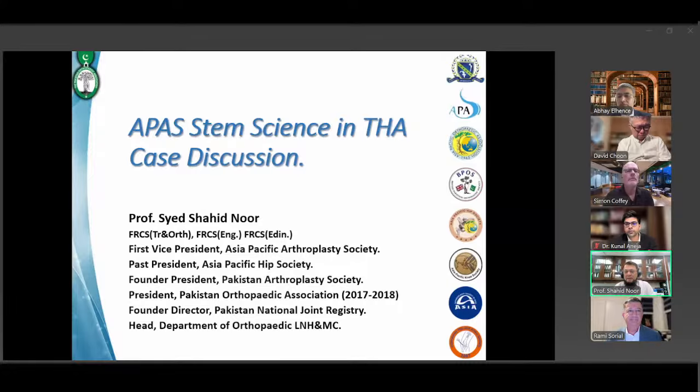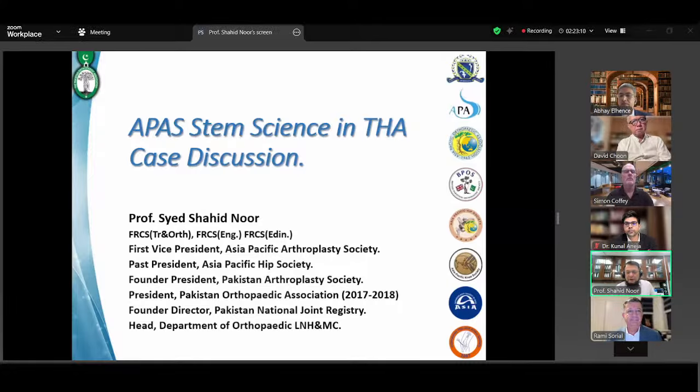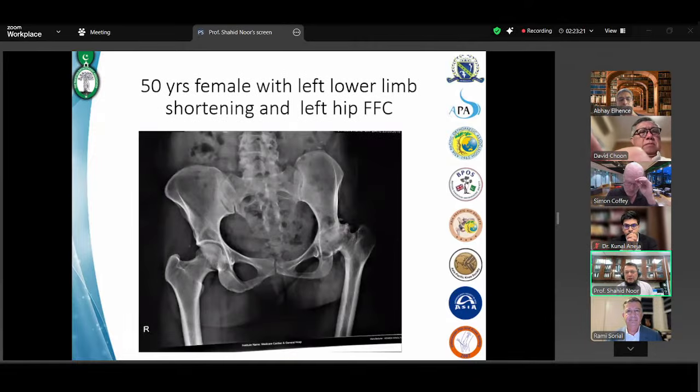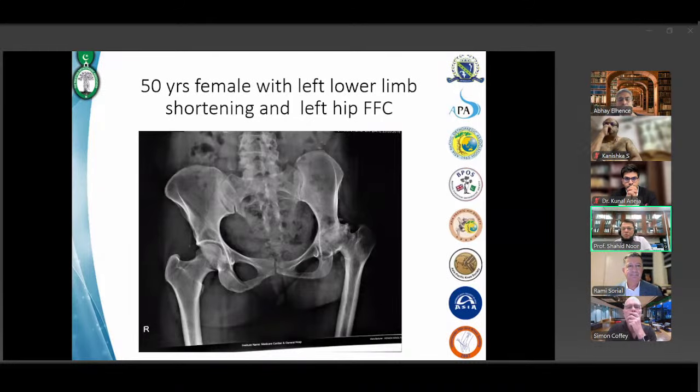Yes, thank you very much, Abhay and Rami, for excellent presentation on different aspects. I'm going to quickly go through a few cases and pose the question to the available faculty and participant if they have question. So this is a 50 years old female, has got a dysplastic hip, and because this webinar is concentrating more on the femoral side, I would like one of the faculty who is available to comment on the anatomy of the femur and which implant are you going to use for the femoral reconstruction.